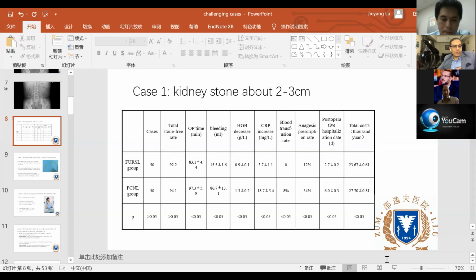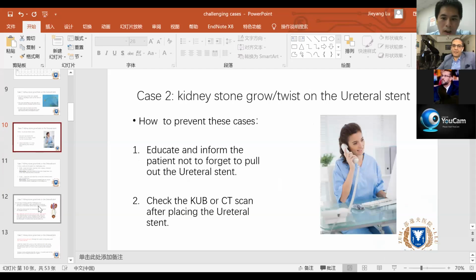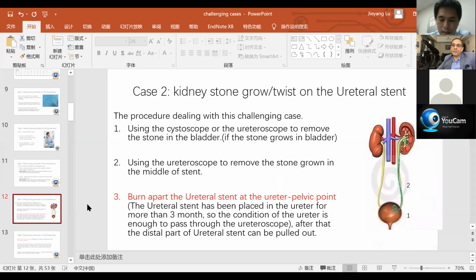I'd like to check with you in cases of duplex. Sometimes if you have a renal duplex system, how can you diagnose it? Usually, the routine is that we do CT without contrast for stone cases, and not all cases can be detected without contrast, whether this patient has duplex or not. Are you doing routine contrast in all cases, or no? No, we don't do the routine contrast.